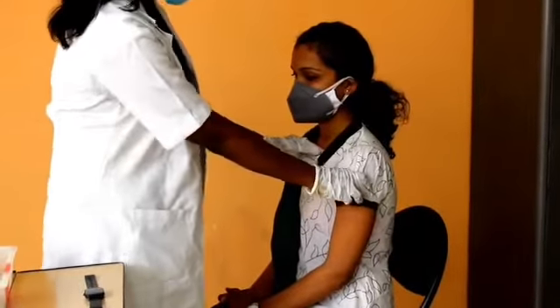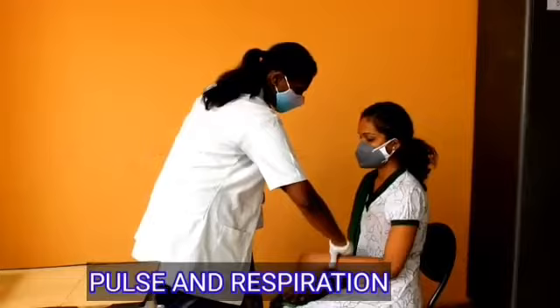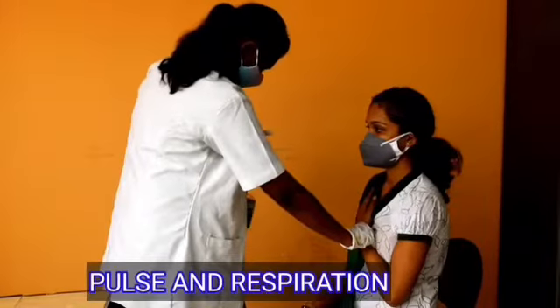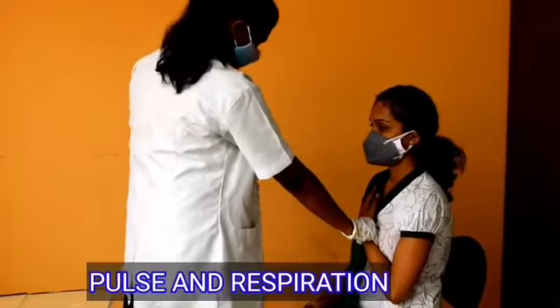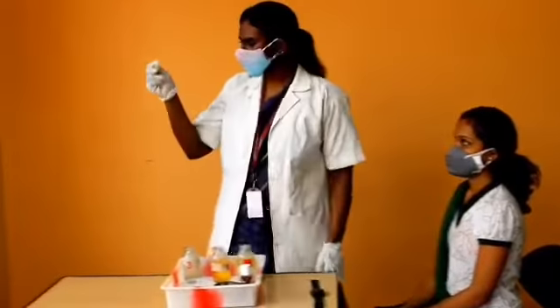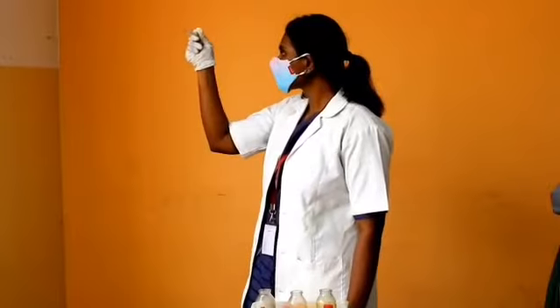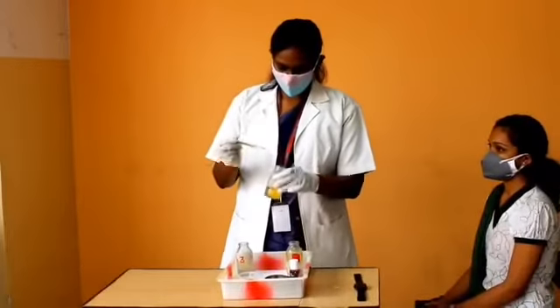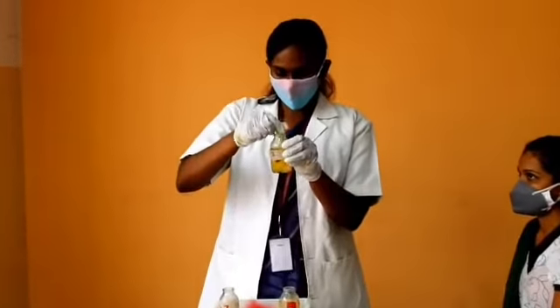Simultaneously, we will be checking the respiration and pulse rate for a full one minute. After two minutes, we will check the temperature by reading the mercury level on the thermometer at eye level. Then put the thermometer in the second bottle.